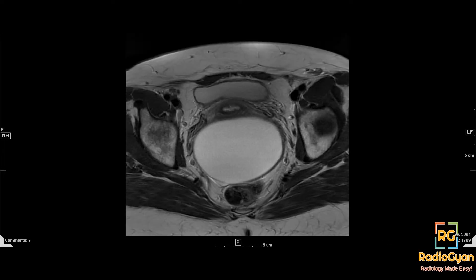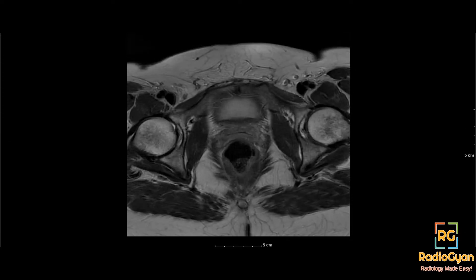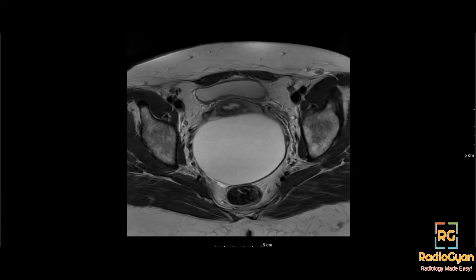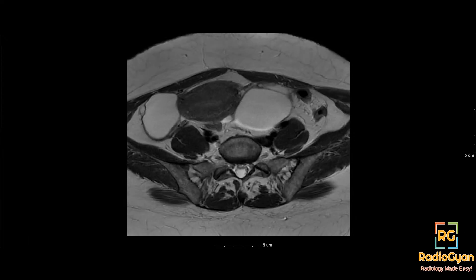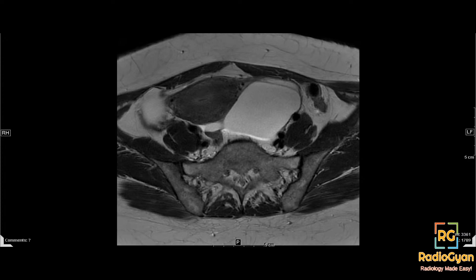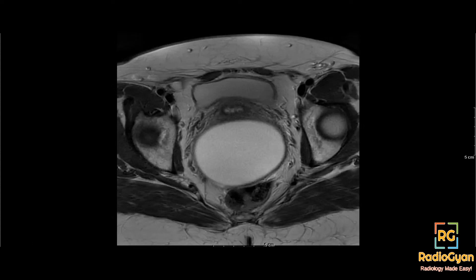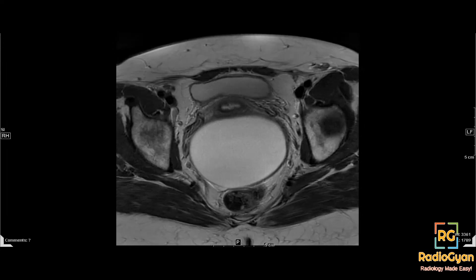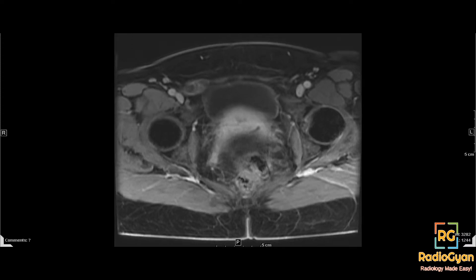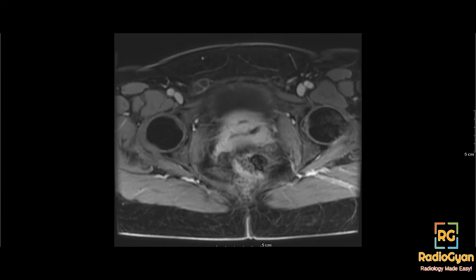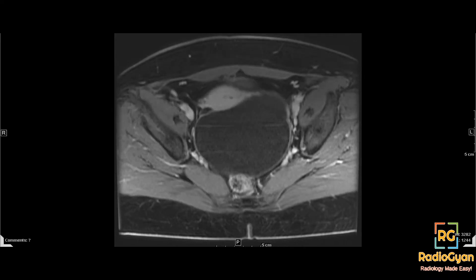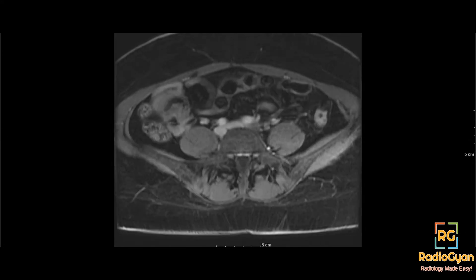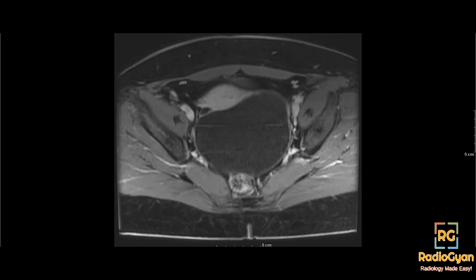These are the MRI images. I'll go over the T2-weighted images. There is a multi-loculated cystic lesion in the right inguinal region, and we again see those bilateral adnexal cystic lesions. I'll show the post-contrast axial T1 fat-saturated images as well. That was the anomaly we picked up, and I initially thought this was a necrotic or metastatic inguinal node.